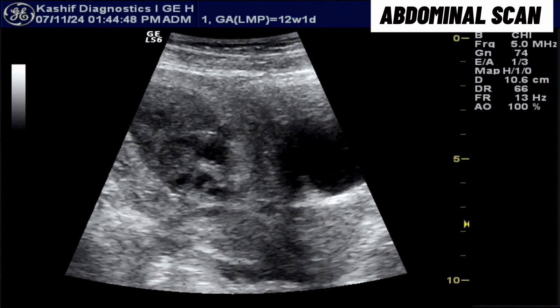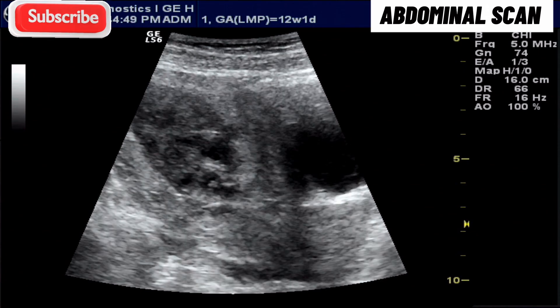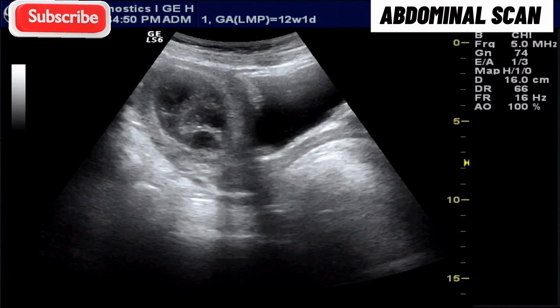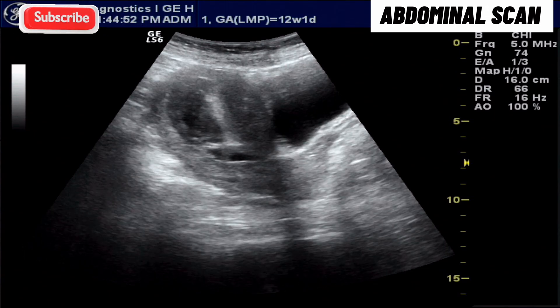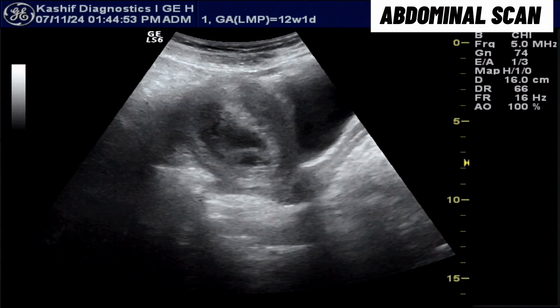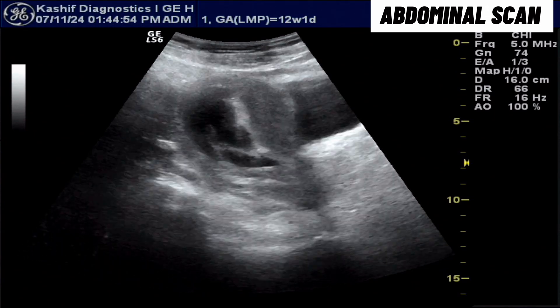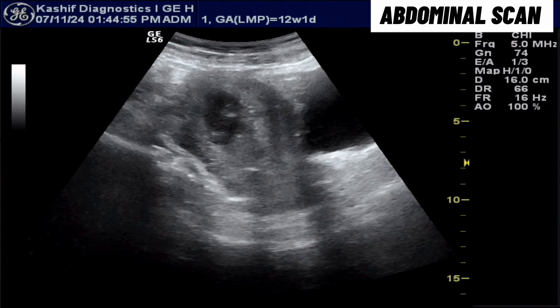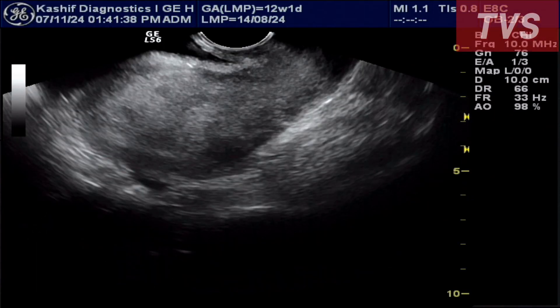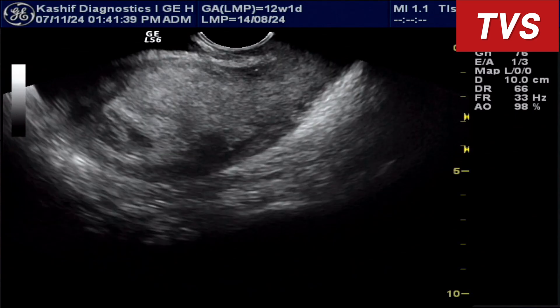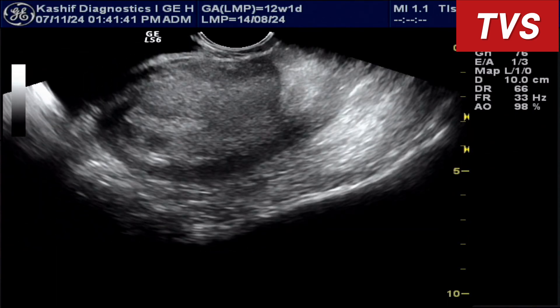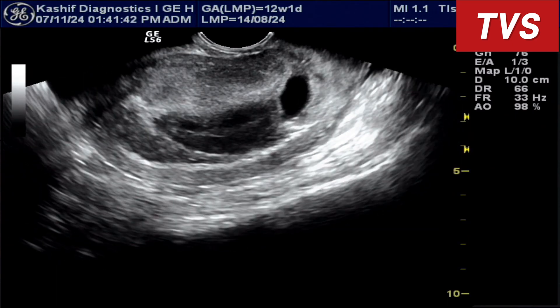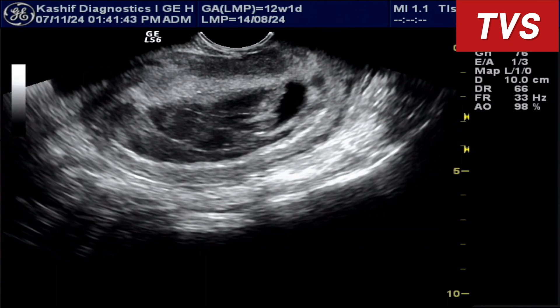At this stage, the ultrasound diagnosis should be clear as to whether the pregnancy is still alive and can continue or not. We have done TVS ultrasound to confirm the diagnosis.